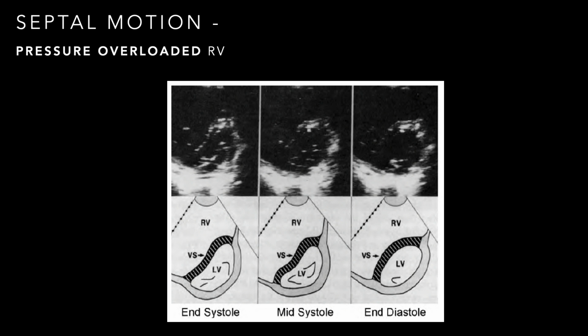It's important to know that significant conduction delays, especially a left bundle branch block, can cause abnormal septal motion and make it look like there is septal flattening where there isn't RV volume or pressure overload. Also know that the D-shaped septum is not diagnostic in RV overload. If it's present, additional emphasis should be placed on confirmation and determination of right-sided pressures and volume overload. So it's an important sign, but it's not the only one you need.